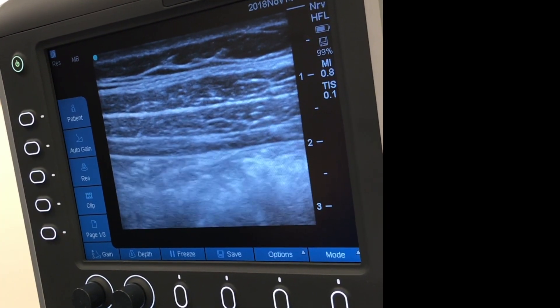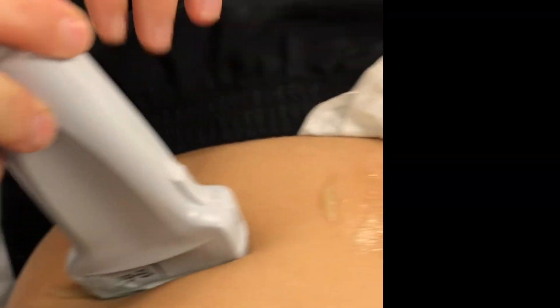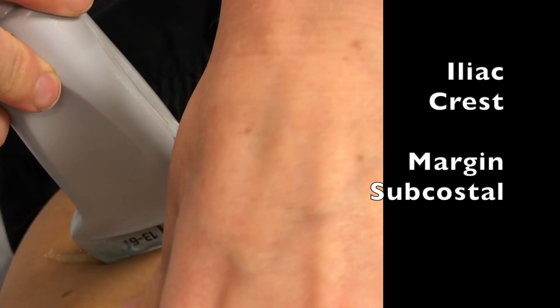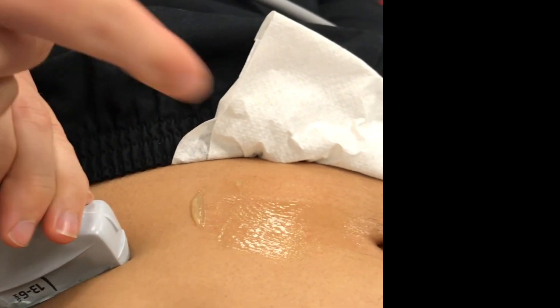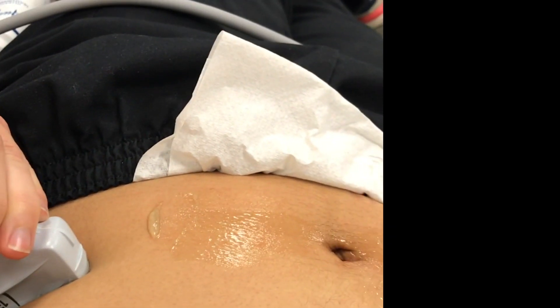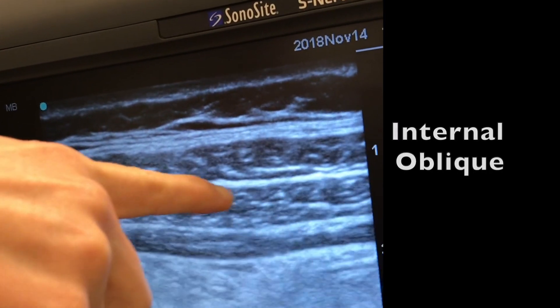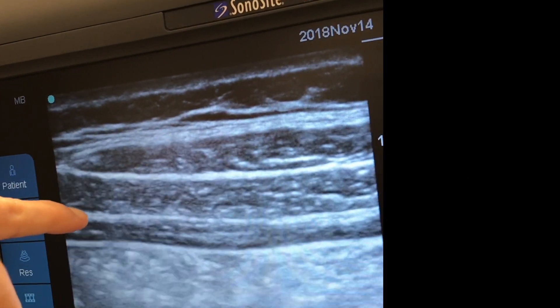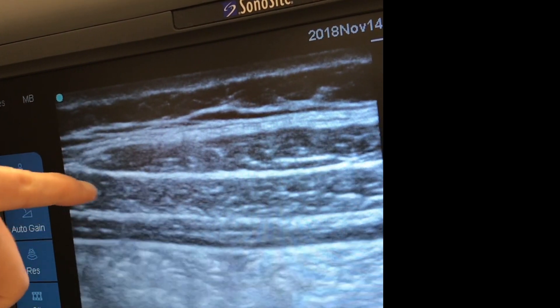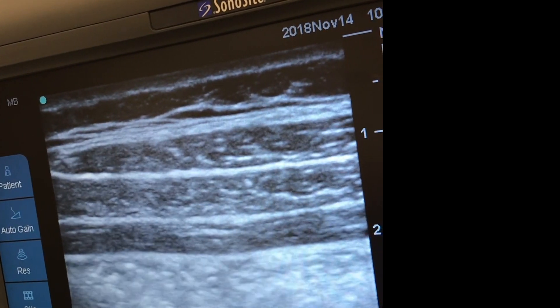This is the TAP block — the transversus abdominis plane block. The probe is placed between the iliac crest and the subcostal margin, in line with the belly button on the side, at the mid-axillary line. Looking at the image, you can see the external oblique, the internal oblique, and the transversus abdominis. The TAP block injects into the plane between the internal oblique and the transversus abdominis. Perfect anatomy on display here.